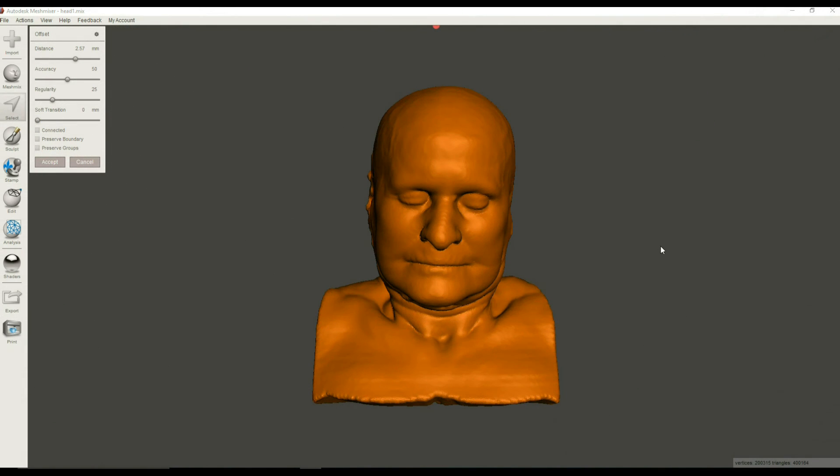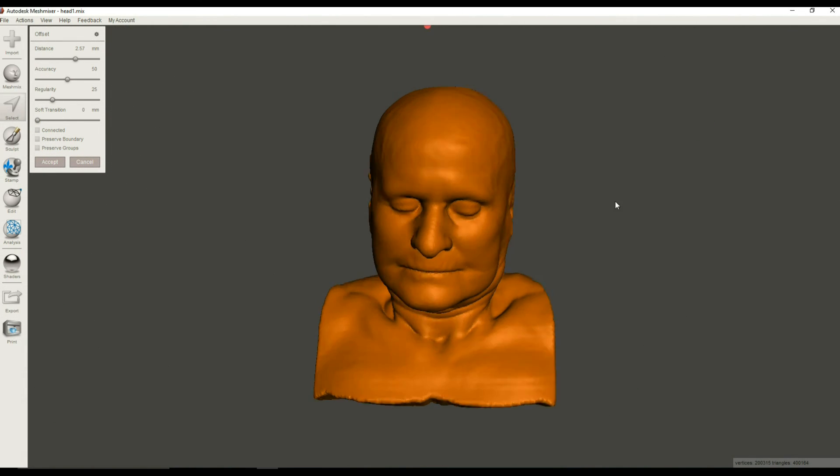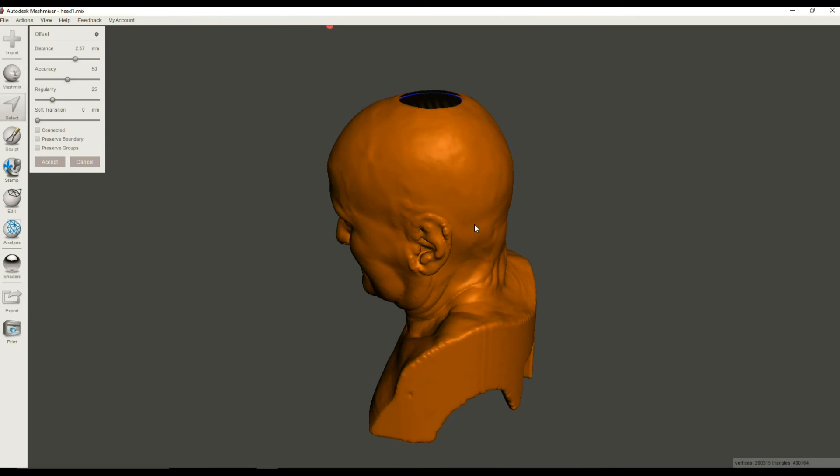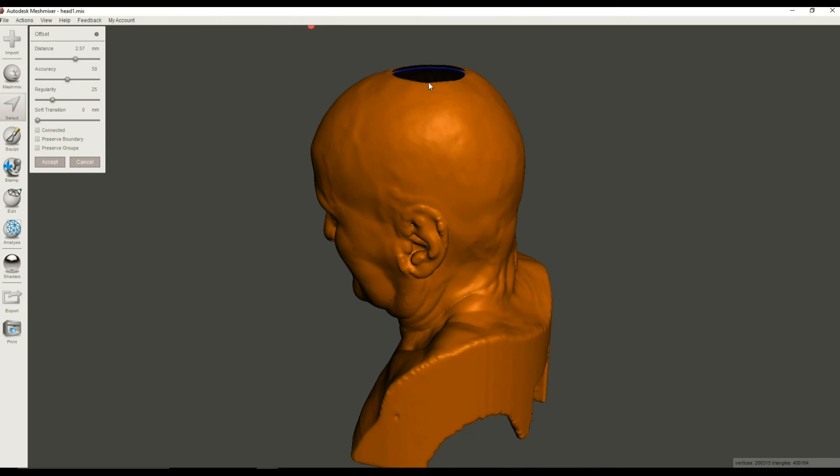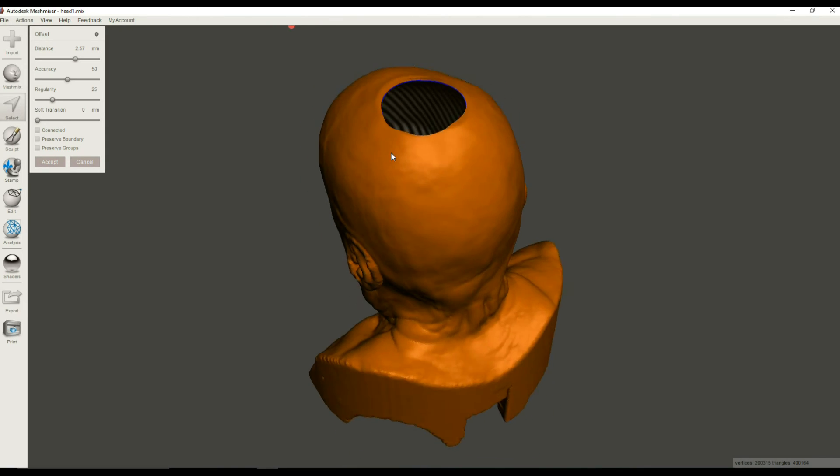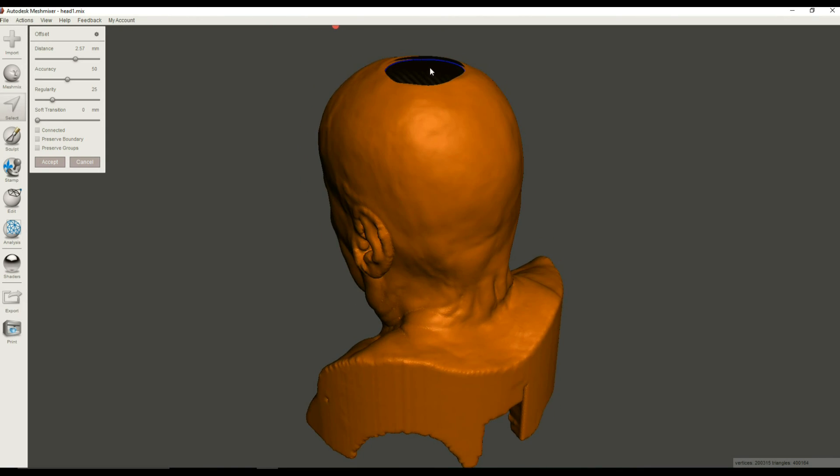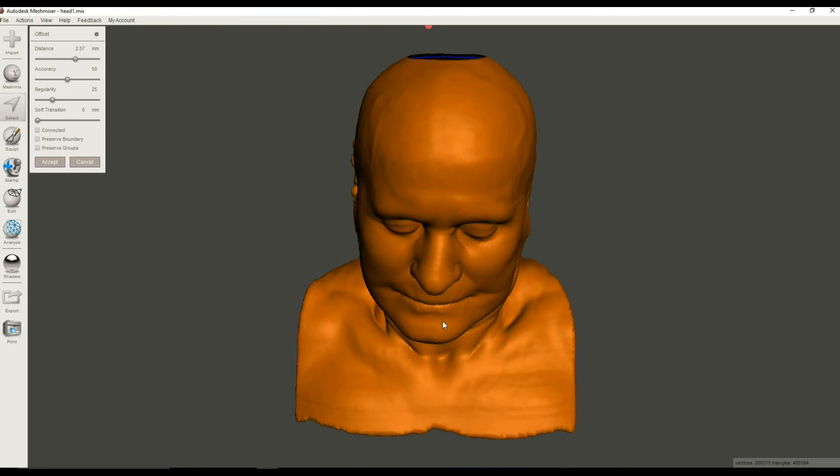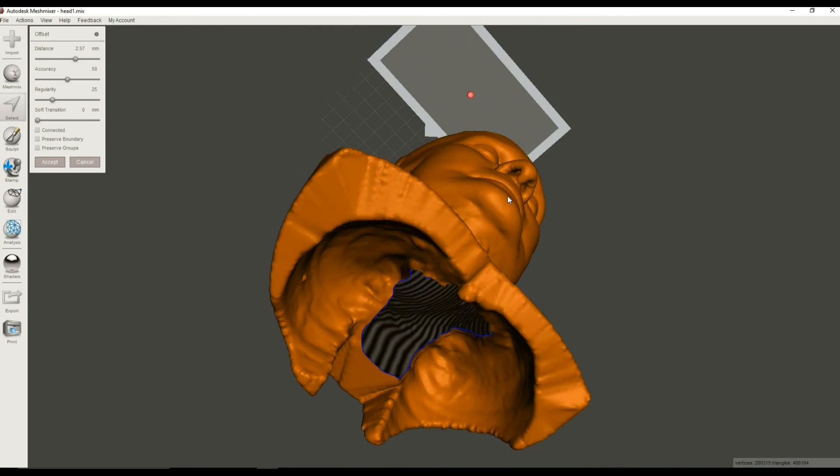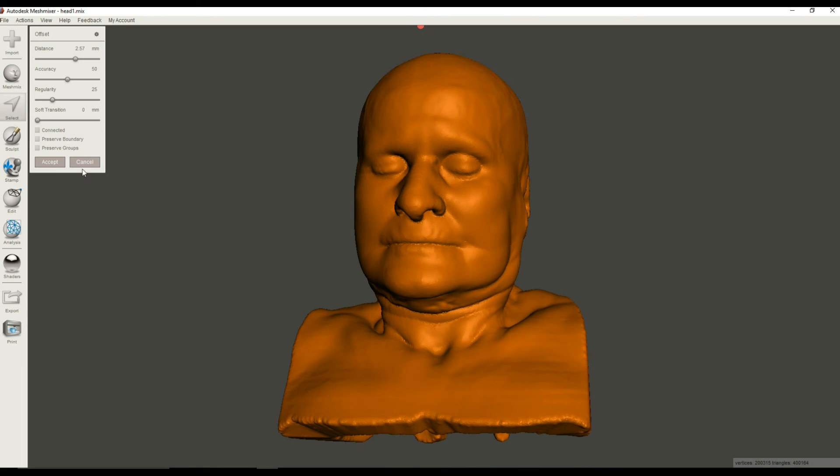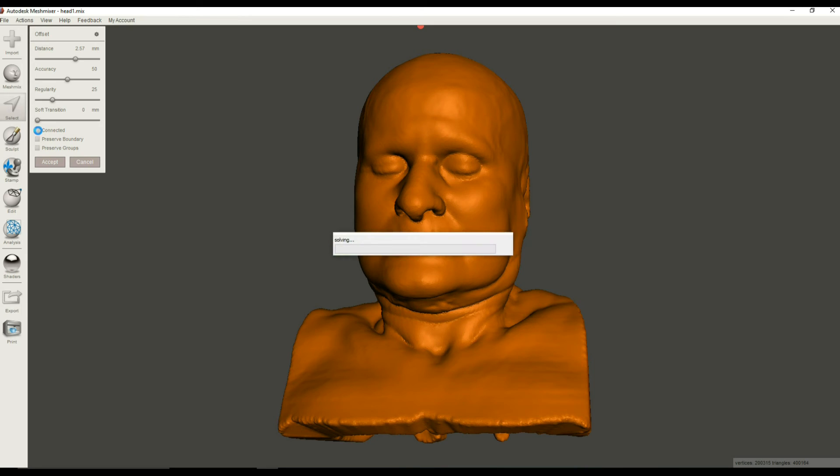Okay, here we are. We're back again and the operation has completed, and you can see that we have two shells. We have kind of an outer shell and an inner shell, and right now they're not connected. They're sort of one inside the other. And that's because on the Offset menu we need to make sure that we have this Connected checked.